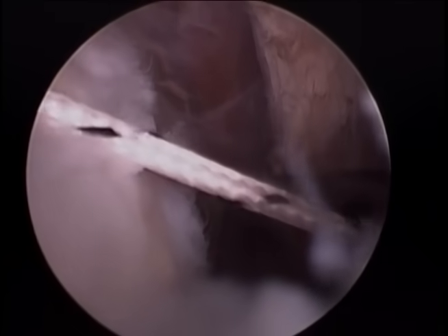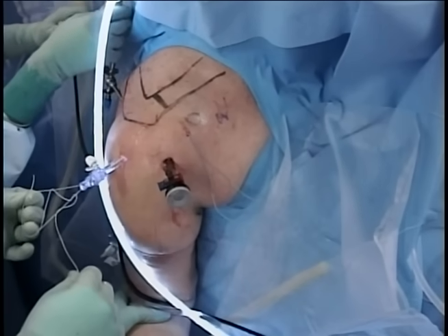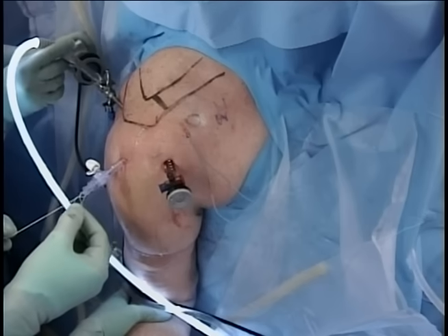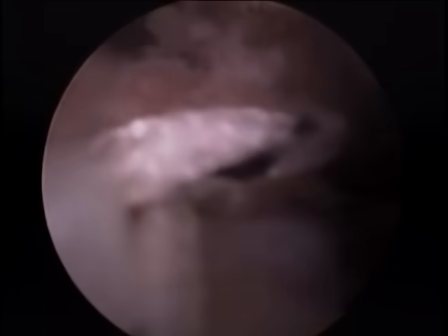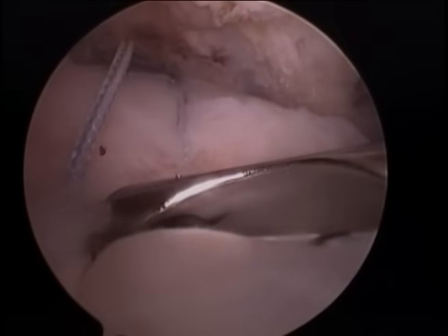Here we took two white sutures. Outside the cannula, we are tying a special sliding knot called the SMC knot. By pulling on one end of the suture, we now slide down into the subacromial space our knot, and our knot pusher device pushes this knot firmly down onto the rotator cuff, indenting the cuff nicely.